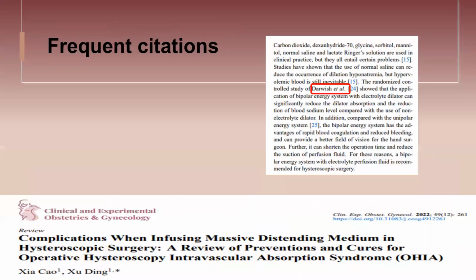And this study is very important to highlight the value of the introduction of saline and bipolar resectoscopy in hysteroscopic surgery. And it has been cited several times, and it was recently cited in one of the review articles on complications associated with the distension media.